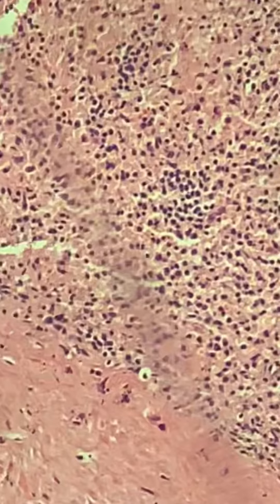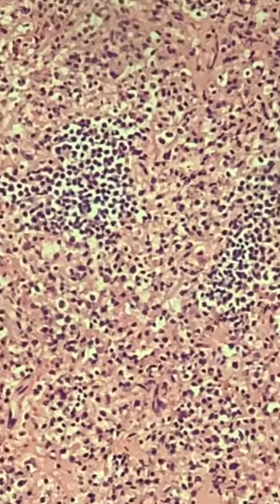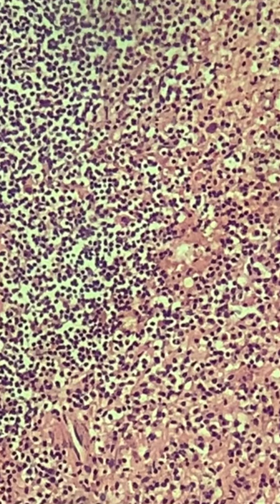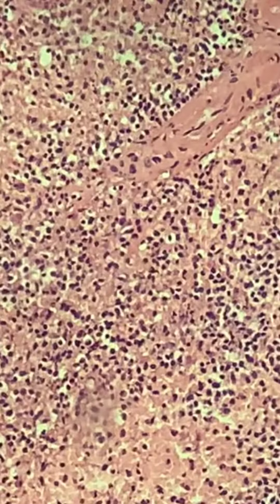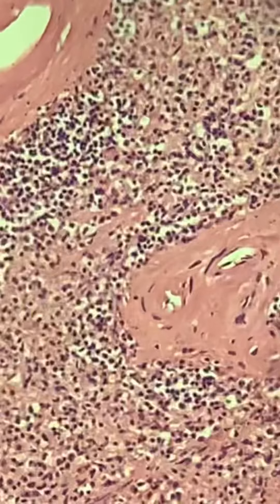Nice trabeculae with the thick-walled vessels. Very nicely normal — a relatively normal spleen doing its job. The person obviously had sepsis so it was inflamed, but other than that this is what a relatively normal spleen will look like.